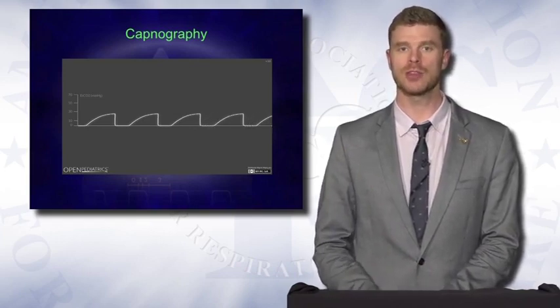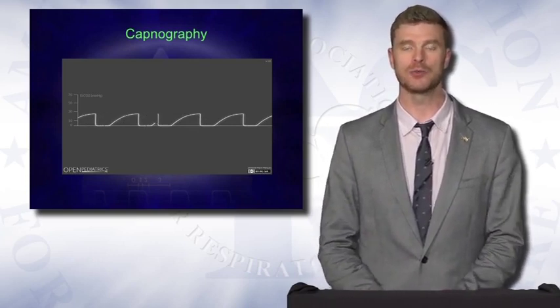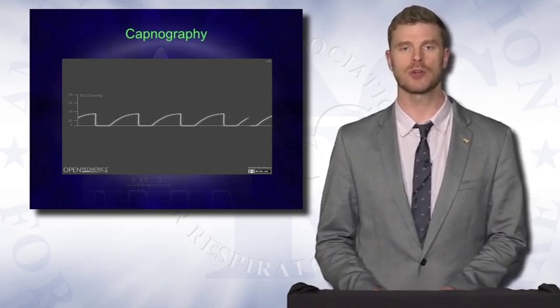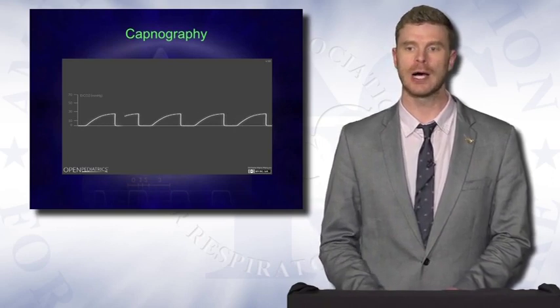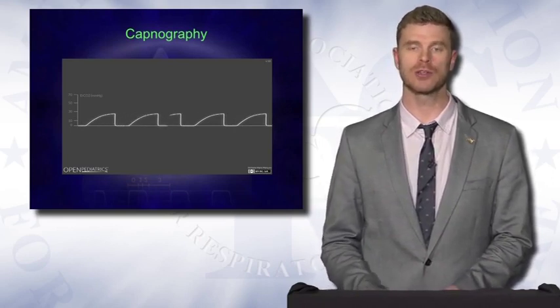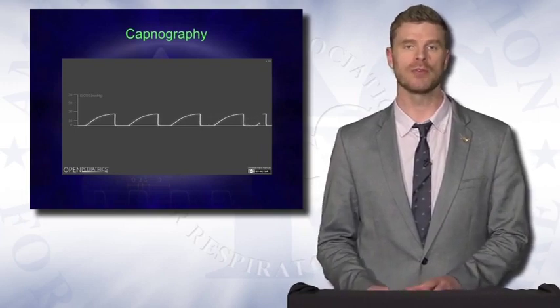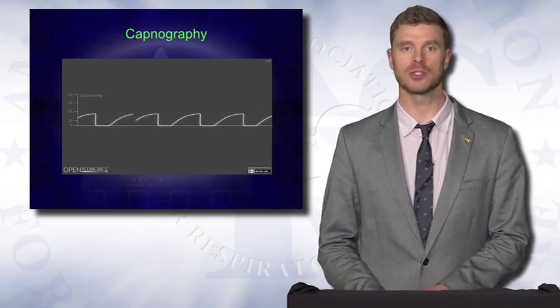I should also note that this pattern does not necessarily mean asthma or bronchiolitis or some other obstructive process within the respiratory system. It could be as simple as a mechanical obstruction of the endotracheal tube, whether it be pinched or clogged with mucus, or it could be a misplaced endotracheal tube that is perhaps gone a little bit too low and is sitting right above the carina, and therefore the tip of the endotracheal tube is obstructed by the patient's actual anatomy.